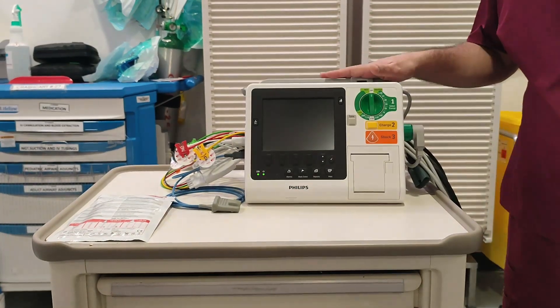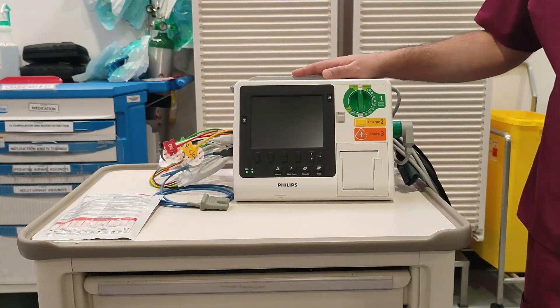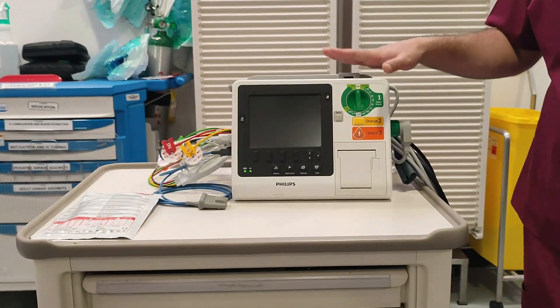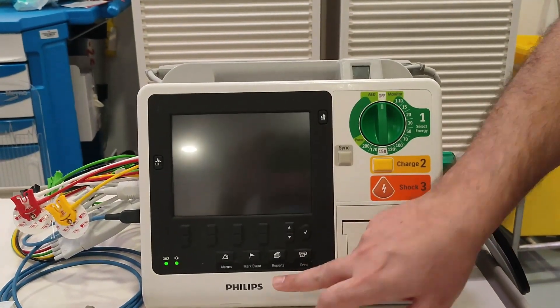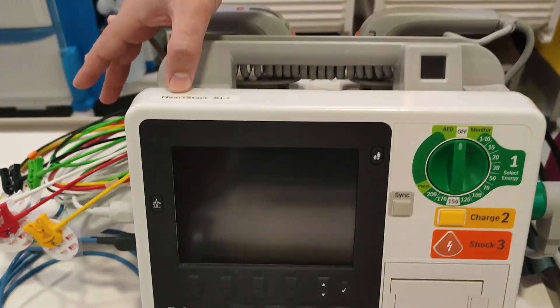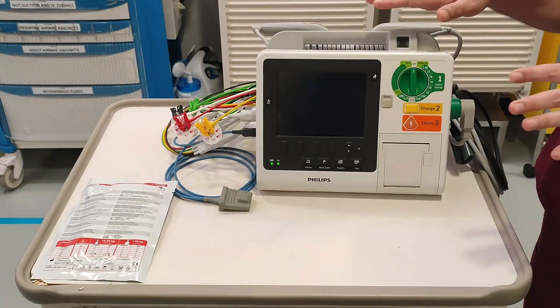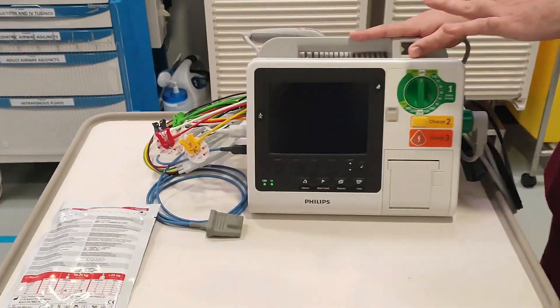Welcome to my YouTube channel. In today's video we will talk about what is a defibrillator machine and how to use it, how to get it ready, and how to deliver a shock. This is one of the defibrillators from Philips — the model is HeartStart XL Plus. We will explain how to use this defibrillator.